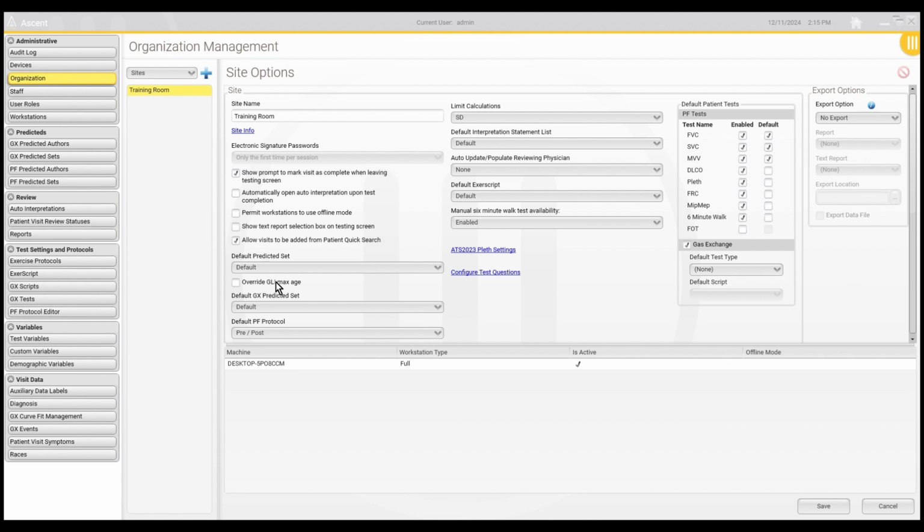The TLC formula will be set to FRC plus IC, which is also not adjustable. And the TLC calculation and best effort will be the TLC formula using average IC ERV, which is not adjustable. Also, if this setting is activated, then the SVC settings, the average IC and ERV are forced true, which is not adjustable.